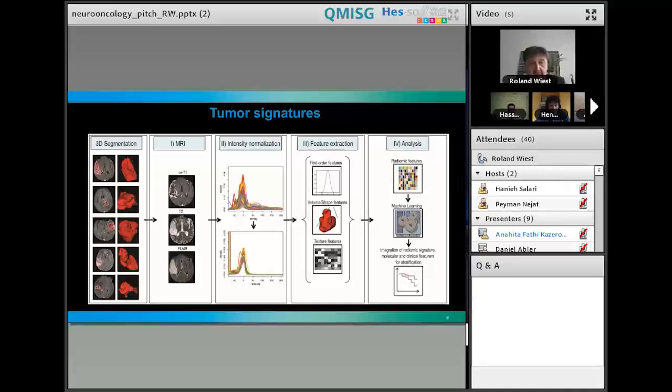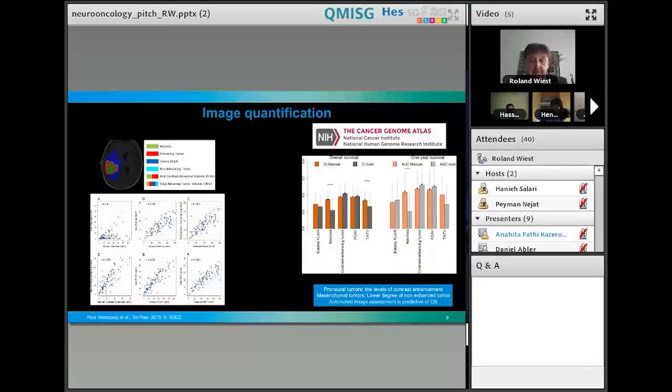So on one hand, there's the longitudinal tumor segmentation. On the second, there's looking at these first order statistics and also looking at the visual features that these tumors encompass. And then thirdly, of course, we look at the deep featuring, that means the higher order statistics that is done by radiomic analysis.